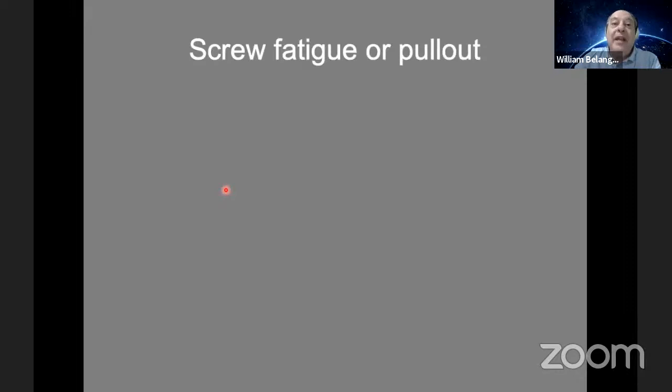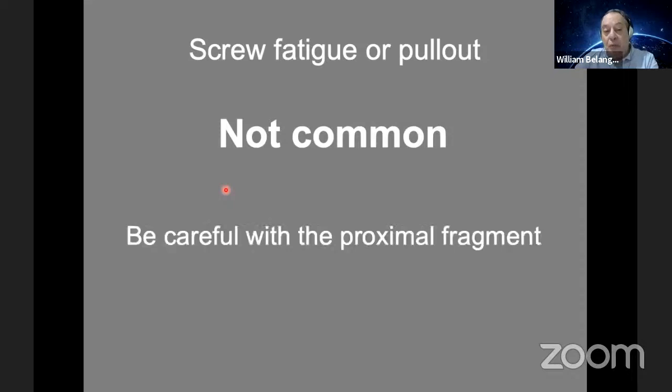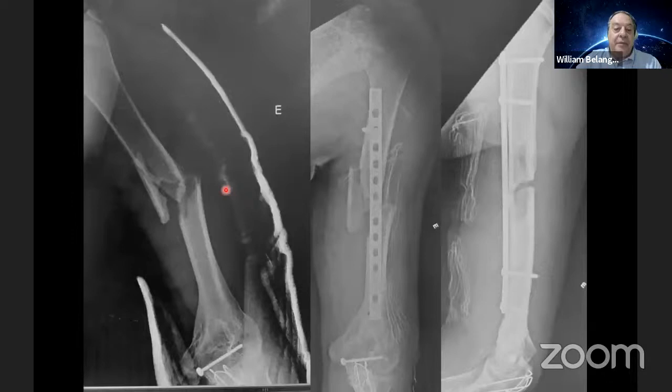Another recommendation. It's very interesting: screw fatigue or pull-out is not common, but I saw all my cases and I think that we need to be careful with the proximal fragment.